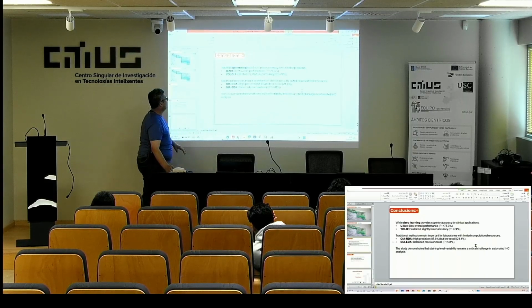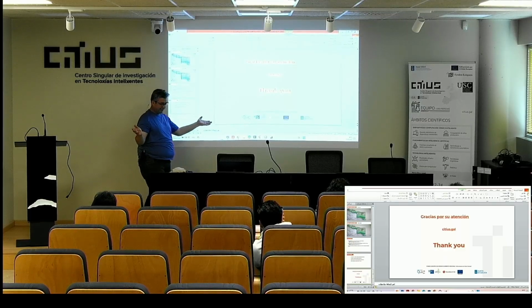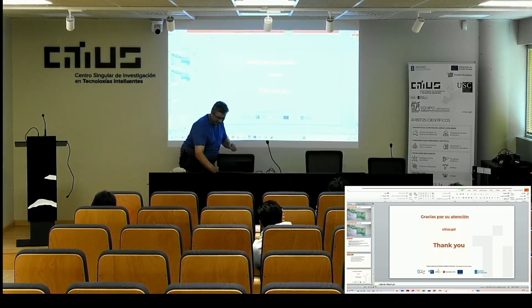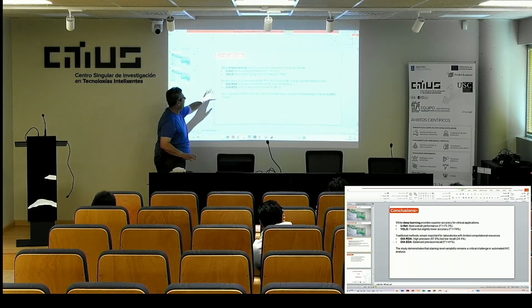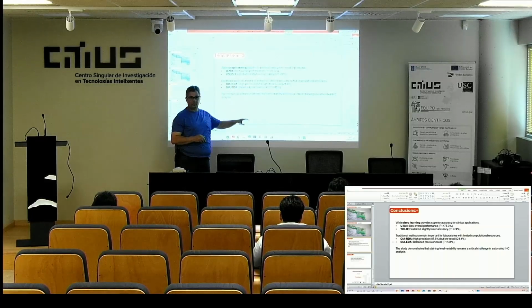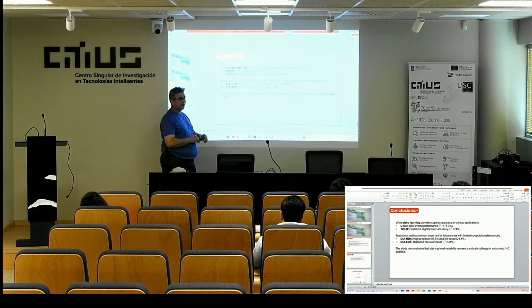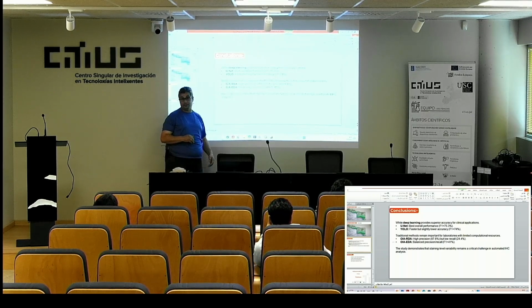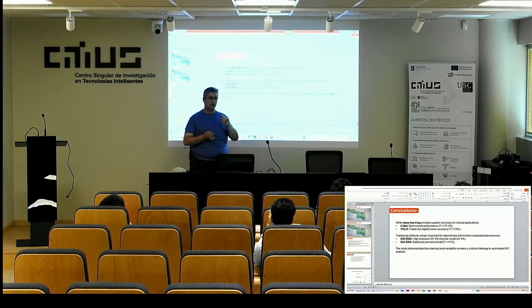In traditional methods, the classical methods we use are region detection and edge detection. These traditional methods are still needed in the laboratory because they are very fast.